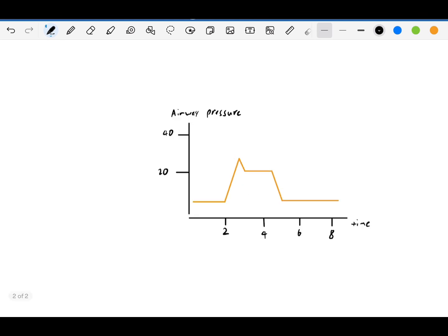Now we're going to get a little more advanced. Say we're still looking at the ventilator monitor, at the pressure over time. One thing that can be done on a ventilator is something called a breath hold. What is that? The vent gives a breath, and then you'll see this flat area, which is your plateau. This portion represents the breath hold. That makes sense because instead of the patient going into exhalation after receiving that breath, you're holding it so that those pressures stay elevated.